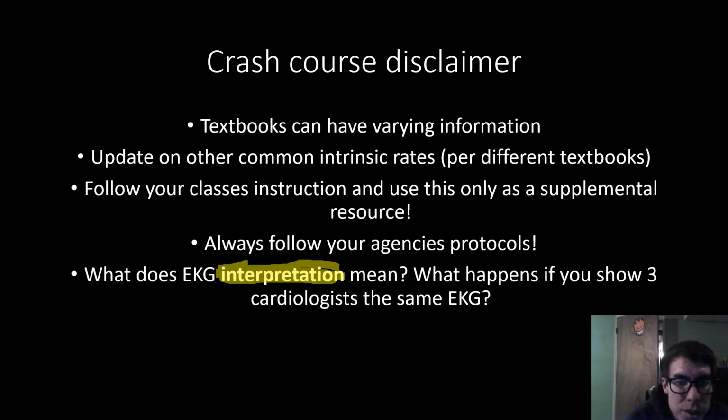So of course there are very obvious things that fall into the criteria of a certain rhythm, but in the end it's really our own interpretation. So even though you technically can be right and wrong, at the same time, that's all it is, it's interpretation. It's kind of what we see when we look at it, in a way.